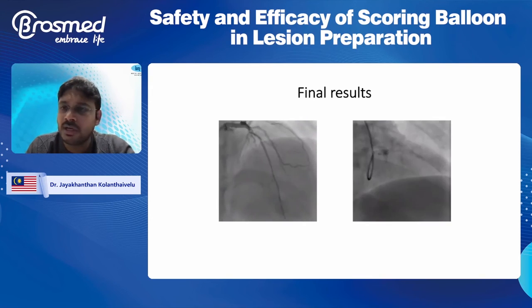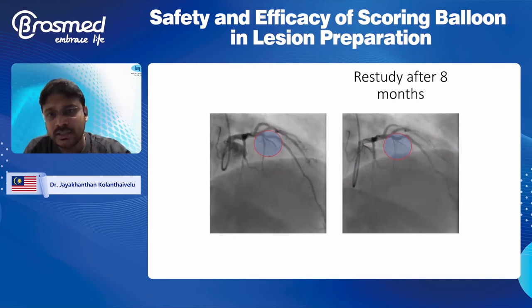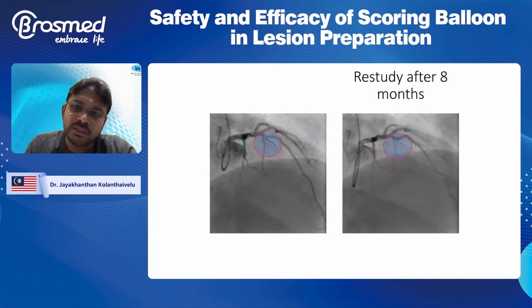I accepted it. Very young chap, brought him back after about 8 months. And you can see how nicely the vessel has remodeled, and excellent results, beautiful results.